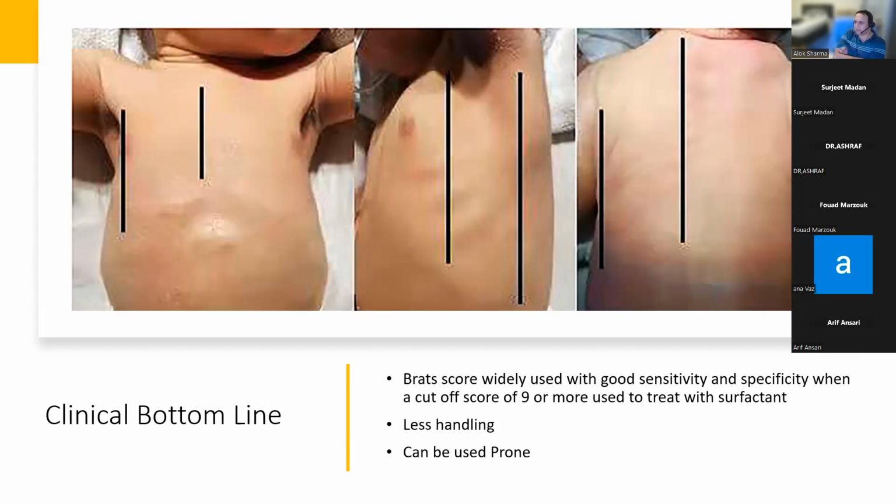But from my perspective, the context has to be clinical. Again, if I decide that I'm going to do a lung ultrasound because the baby's in 60, 70% an hour later, and I get complete whiteouts in both lungs, again, the question is why? Is that just lungs that are full of surfactant? Have I got an obstructed tube? Is this a baby who's recessing against the ventilator? Is the airway the problem here because the tube is partially obstructed with surfactant? The real question you have to ask yourself is, sticking to that approach, and then interpreting your lung ultrasound in clinical context as to when you do it.